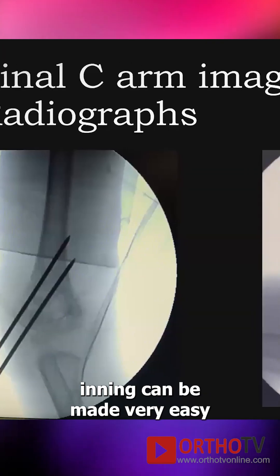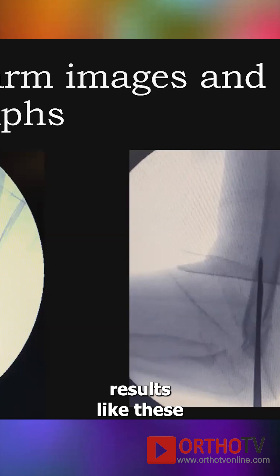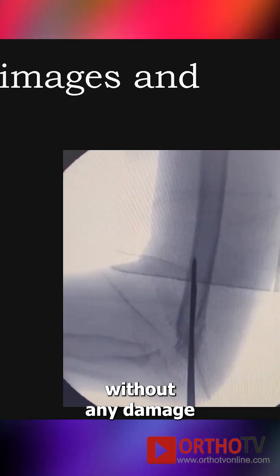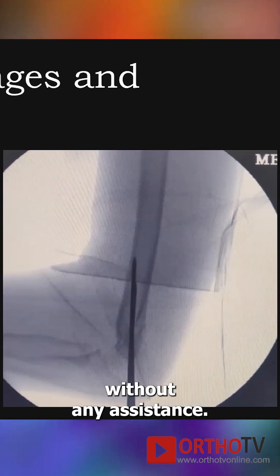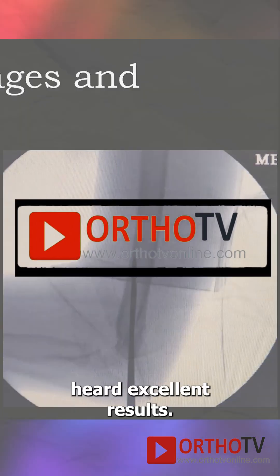Supracondylar pinning can be made very easy and you can achieve consistently excellent results without any damage to equipment and without any assistance. We've been doing this method for over 15 years and have had excellent results.